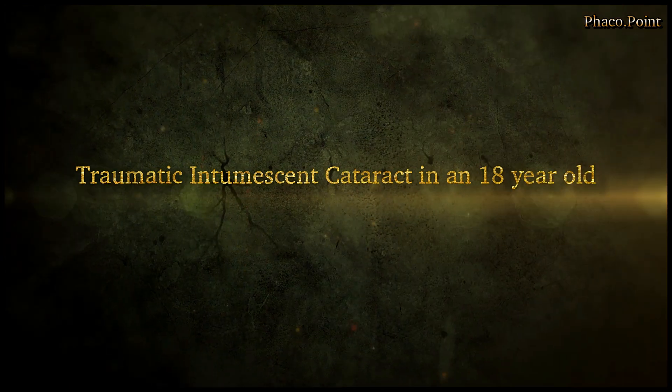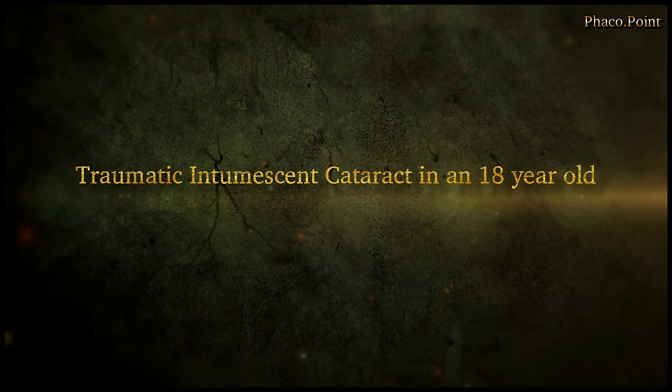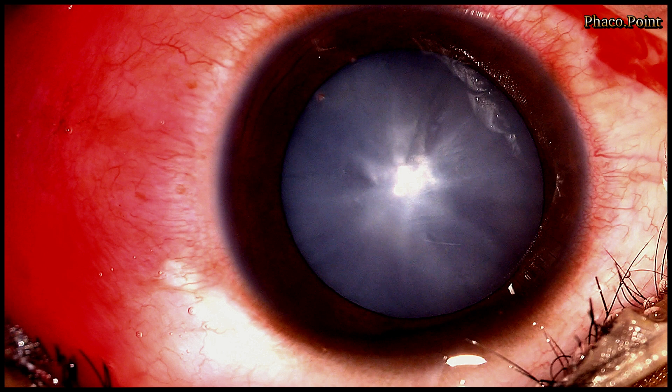We start with the first case which is an intumescent traumatic cataract in an 18-year-old male patient. This young patient presented a week after sustaining blunt trauma to his eye with this appearance. As you can see, we have a total cataract.